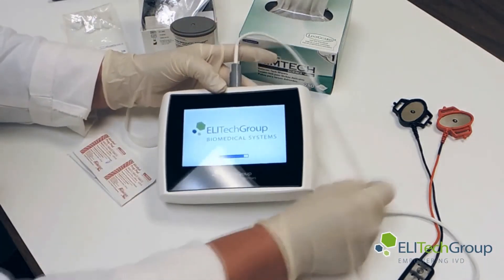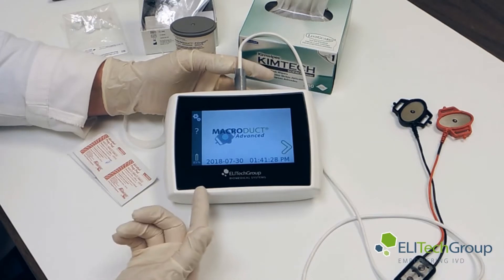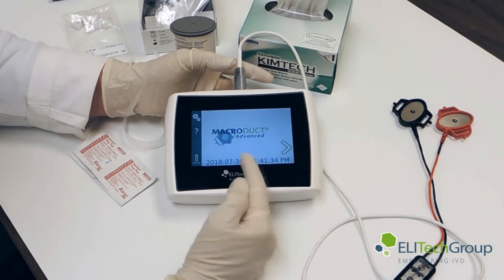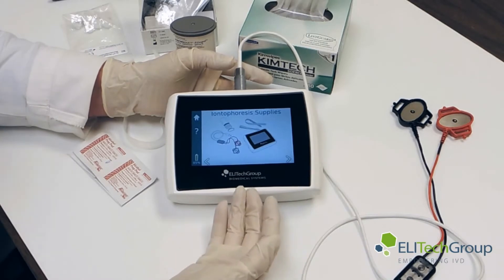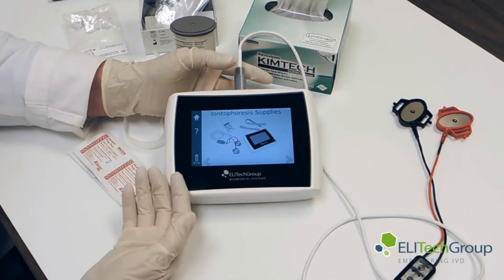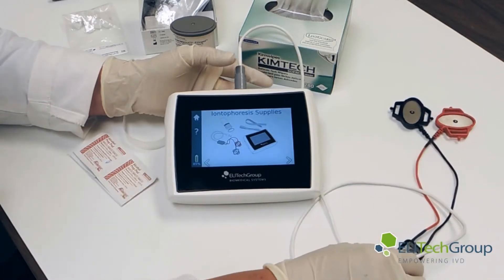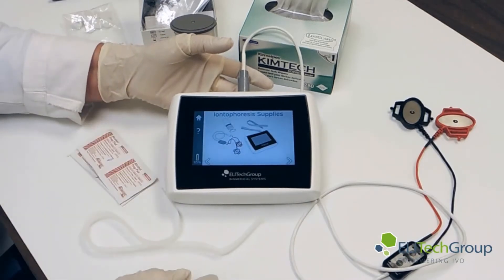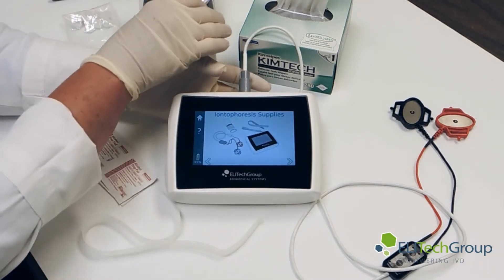What we'll need to do now — you can see it's still powering up. As we go through the screens, it will show us step-by-step what we need to do. You can see we have the MacroDuct Advanced System. It has the date and time. The screens show us ionophoresis supplies: the cables we connected, straps for the collection MacroDuct, and the PilotGel disks.